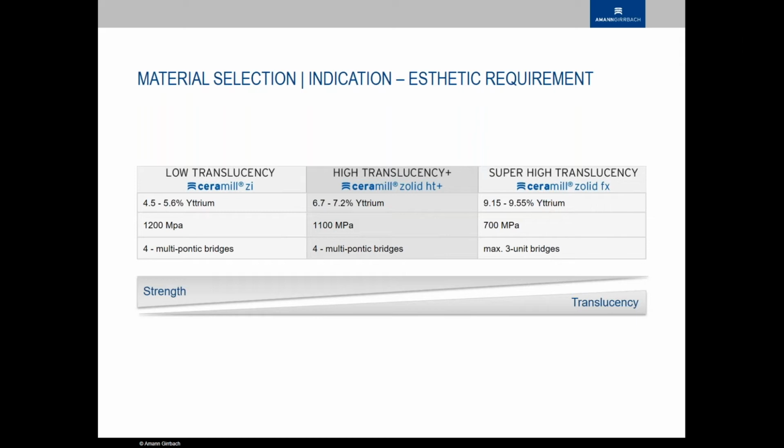On the other zirconias, that might not be exactly like that, depending on the amount of yttrium, depending on, I don't know what, but for the cubic zirconia, that should be pretty much like that, if it were even changing the phase.